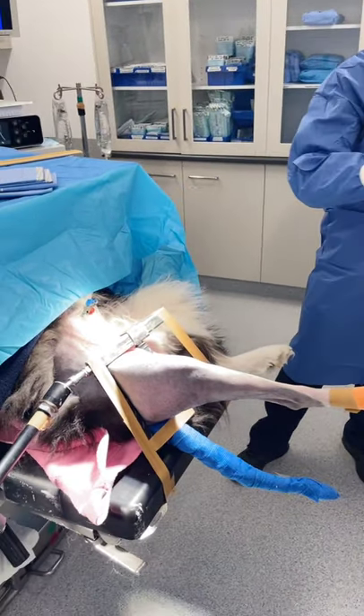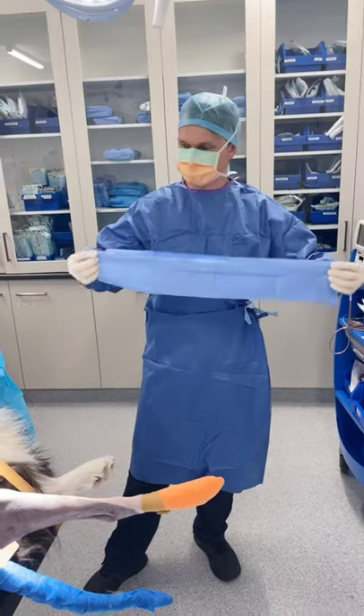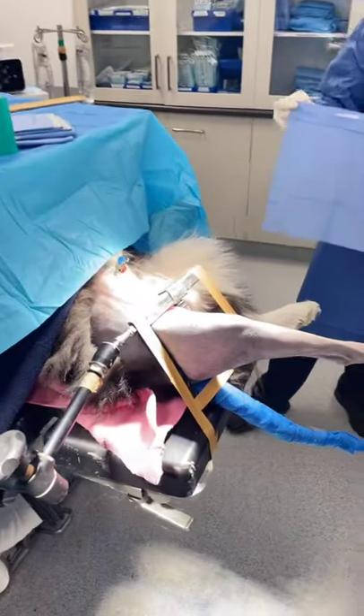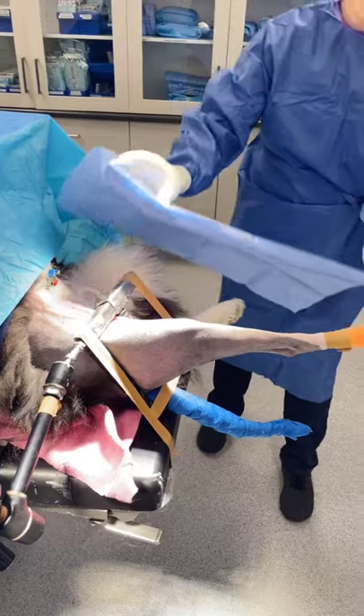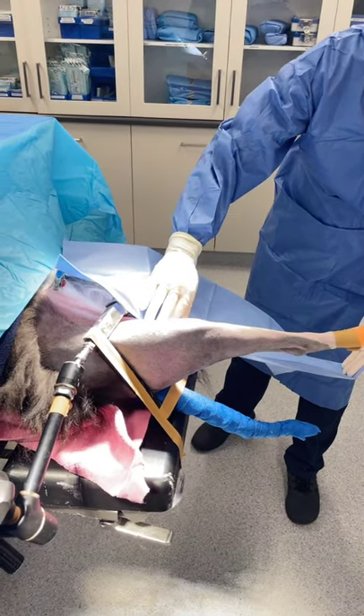G'day guys. Dr. James here from Beddojo, and we're here with one of our surgical residents, Ewan. We have a patient here that's going to have a TPLO, and I just wanted to go through something a bit different with you and show you how we do our sterile leg prep.